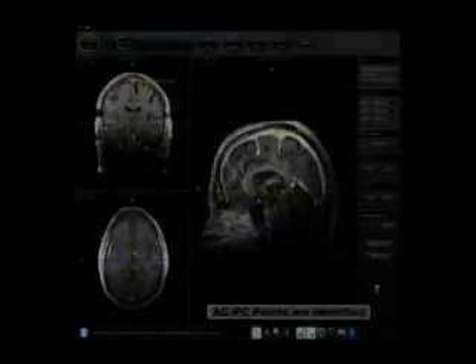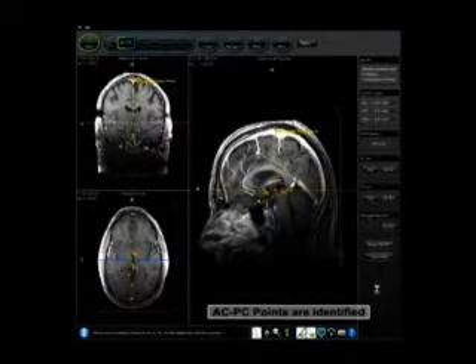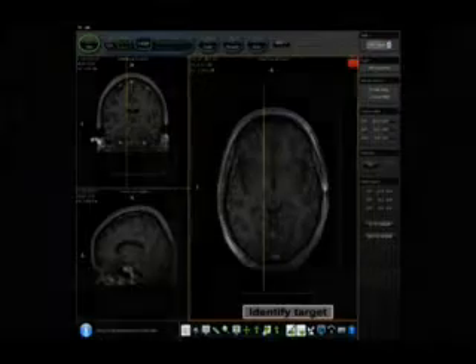The MRI scanner begins collecting high-resolution images of the patient's anatomy. These images are shipped in DICOM format to the ClearPoint workstation and presented to the physician. From these high-resolution images, the physician can see and select the neurological target, which in this case is the left subthalamic nucleus.